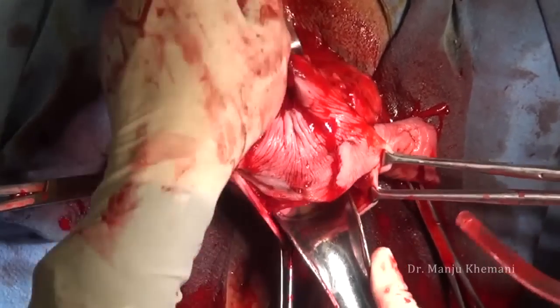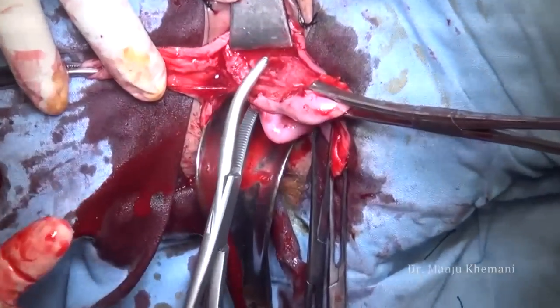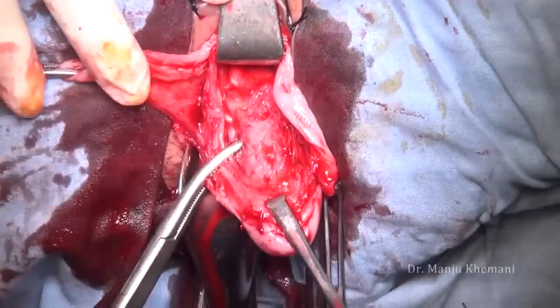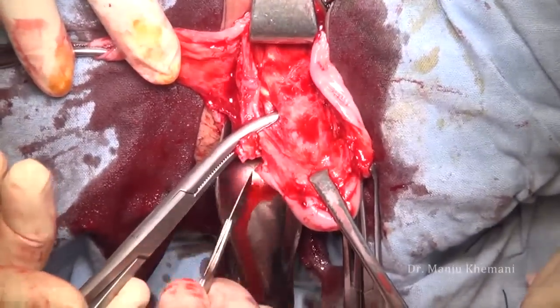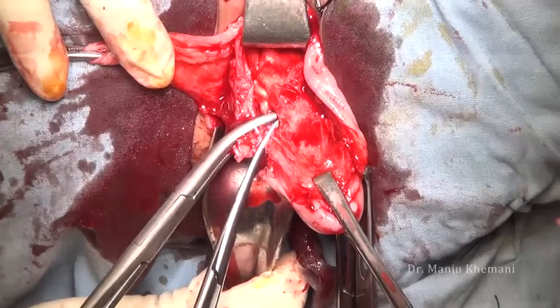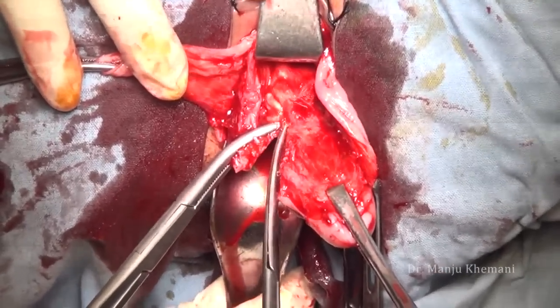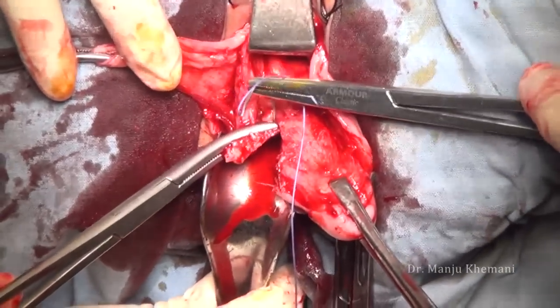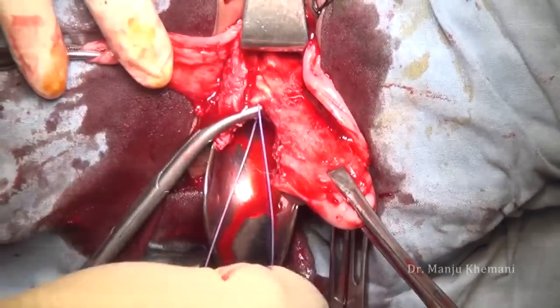Put a speculum there. Now, to take the first clamp, your finger has to go behind the uterosacral ligament so that you catch hold of the complete uterosacral ligament. When you are cutting it, leave enough stump on the clamp side so that it does not retract. This is the uterosacral along with some part of the cardinal ligament. Number one Vicryl is used to transfix the pedicle so that it does not slip.